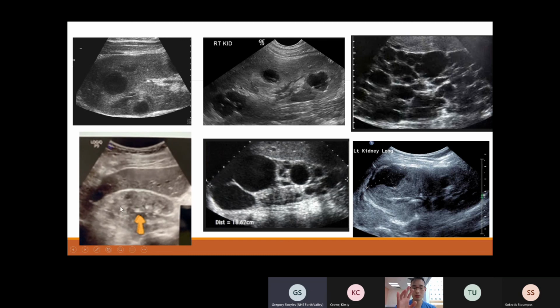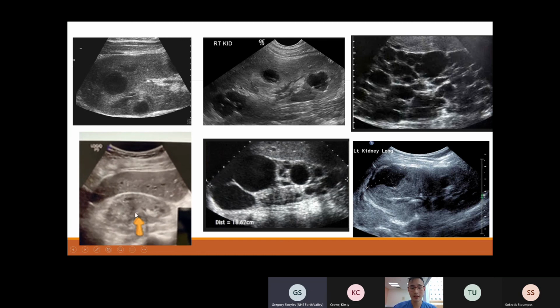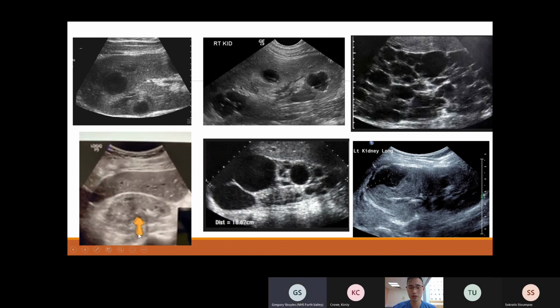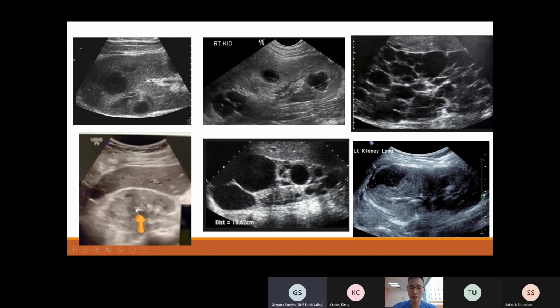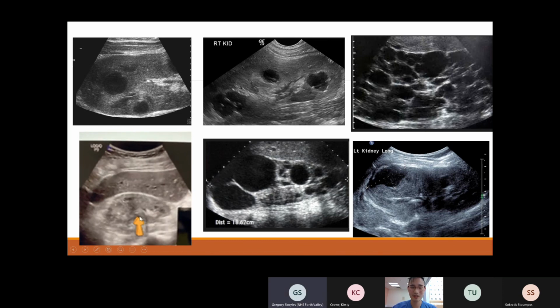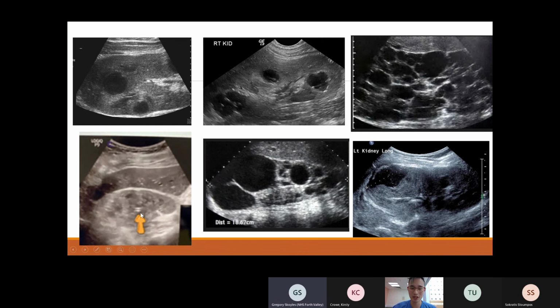All right. So there is an abnormal structure that is very dense, that is giving post-acoustic shadowing. And what you have here is a tubular structure, and what actually you have here is a stent. This is a stent that's going through your kidney, which I thought was interesting.